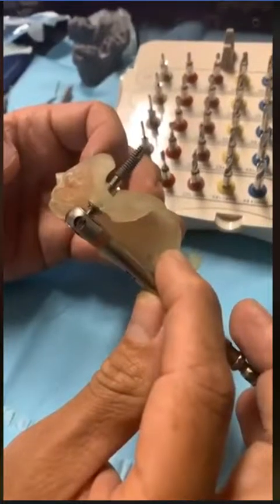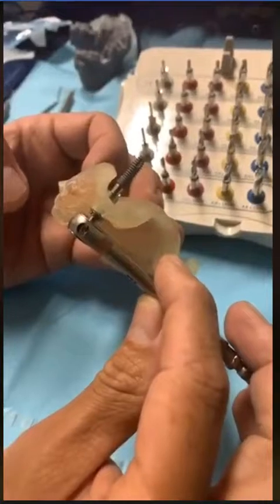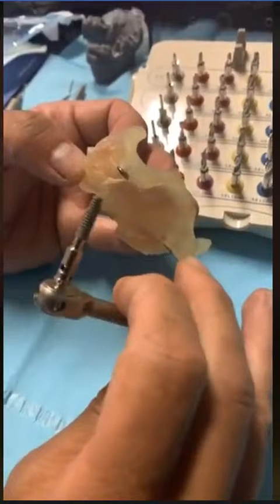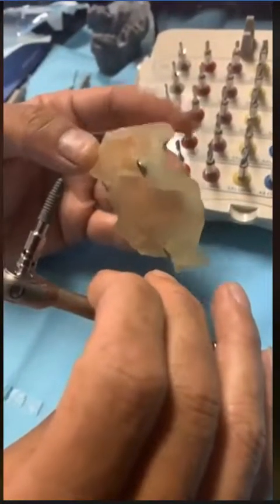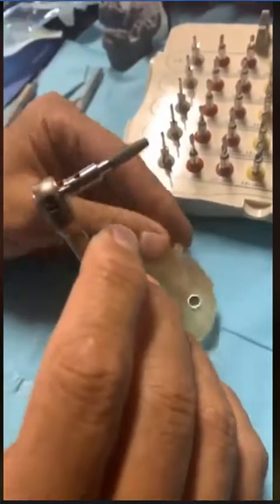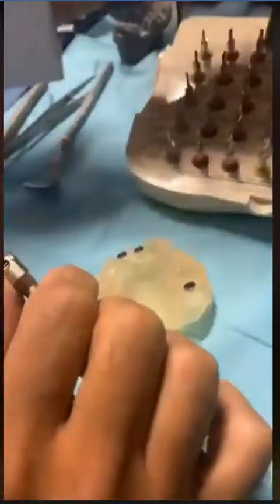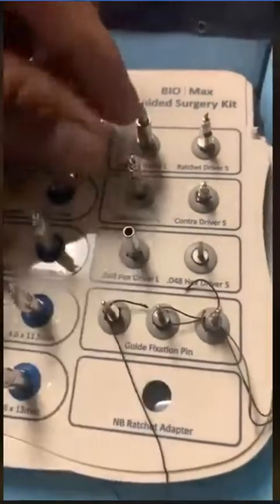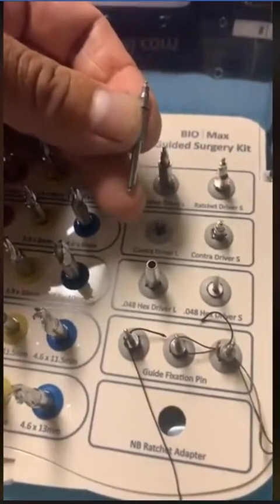With the MIS, for example, yesterday, I'm going to show you some photos of the surgery that we did on my computer, and place this implant. I'll show you on that case how it is, but I had to remove the guide in order to place an implant and use the MIS carrying tool. Now, with this particular guide on this kit, you do not get a carrying tool for your handpiece. Okay, this is a carrying tool for the implant, but this is a latch type that goes into your handpiece.